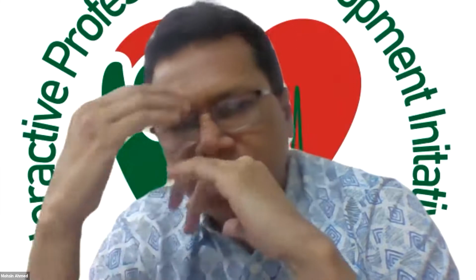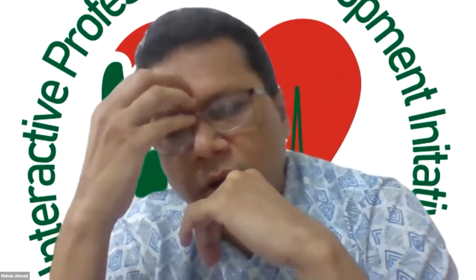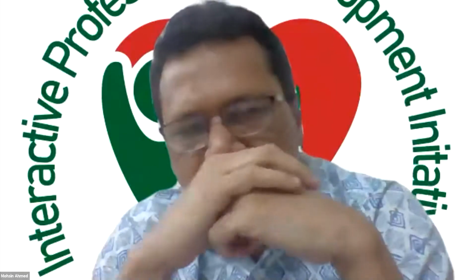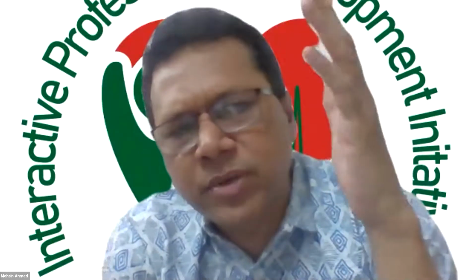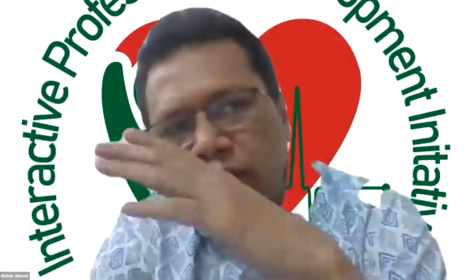For the beginners, when you start the CTO, we regularly do antegrade PCI, but we want to start retrograde PCI in our labs, because you know there is about a 50 to 60% chance of failure with antegrade PCI. We should switch to retrograde PCI.